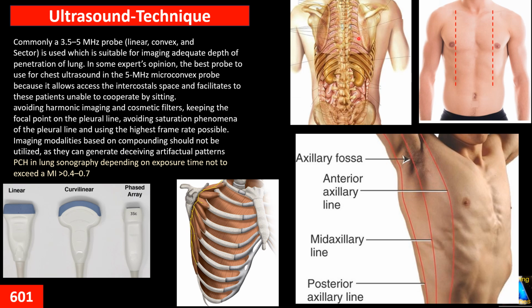For the line of our scanning, the holding and orientation of the probe is sagittal, meaning we put the marker toward the head, and this way. In those situations where we have pathology inside the lung, we better do transverse too. We put it between the intercostal spaces and survey that area from medial to lateral, and the same way in the lateral space and posterior space.